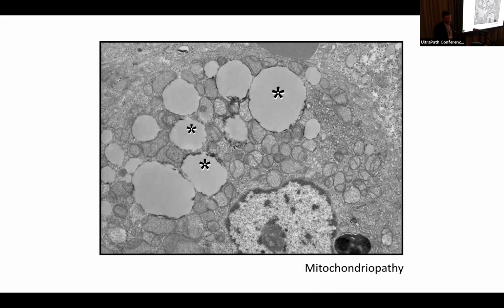We were talking a little bit about this at breakfast, but there's a lot of variability in the abundance and the appearance of mitochondria in the hepatocytes. And so being able to confidently identify mitochondria in liver, or primary mitochondriopathy in liver, can be really challenging. In fact, we are in the middle of a mito-hep research group that is trying to identify how good we are with just EM and histology at recognizing a potential mitochondriopathy in the liver, and it's not an easy thing to do.